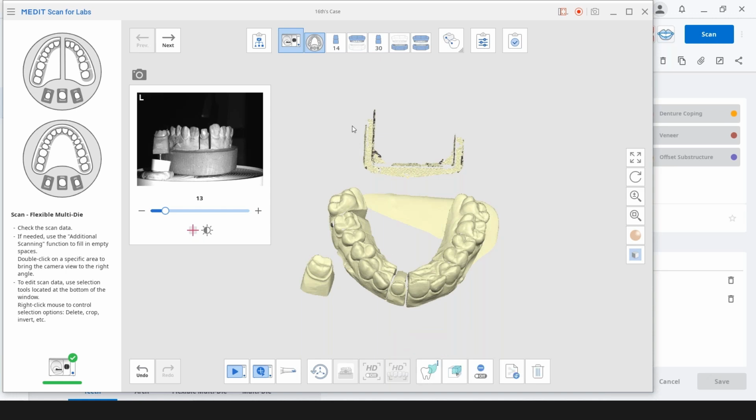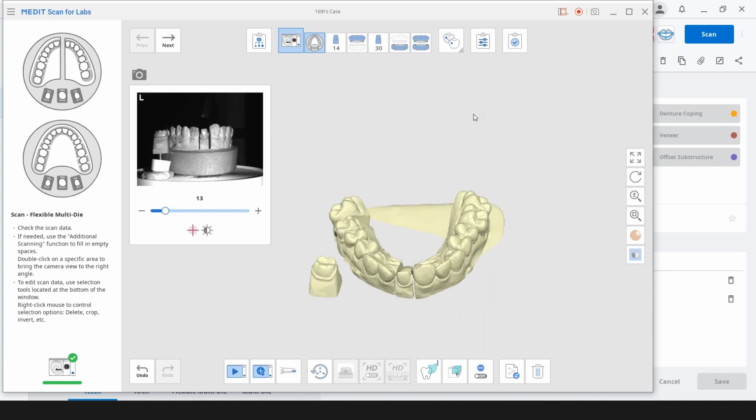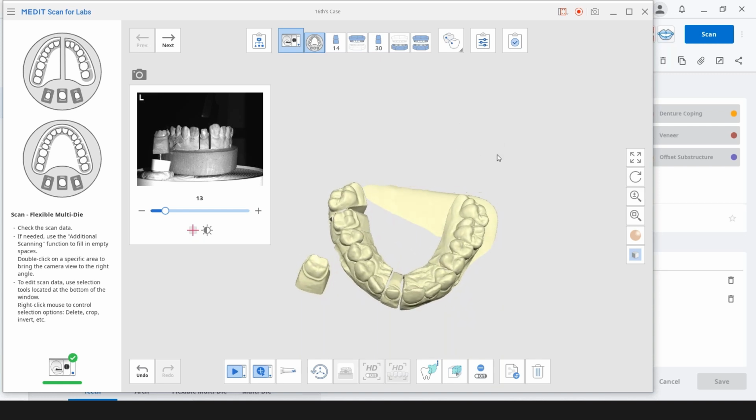So if I did click on this one, I can left click on the mouse, draw around it, release, and it'll say delete or crop. So here I want to delete. If you happen to outline something in green and those options are gone, just right click on the green part again and it'll bring up the delete and crop options again. Okay, and then in here, this would be fine. Sometimes you can do a tracing option where you do the same thing, tracing into here. Okay, and delete. So right click, delete.